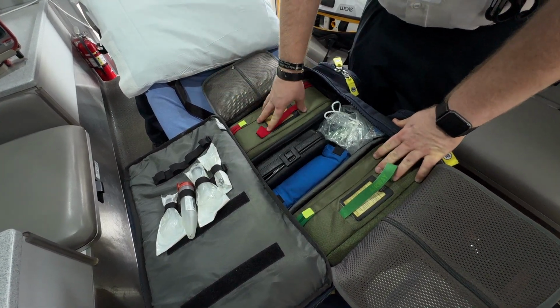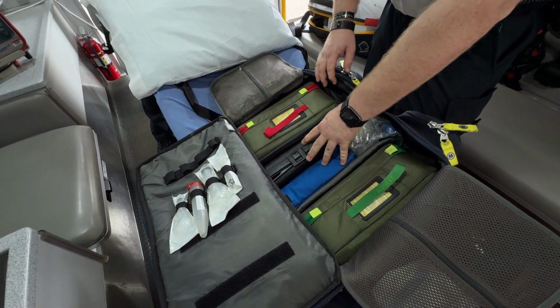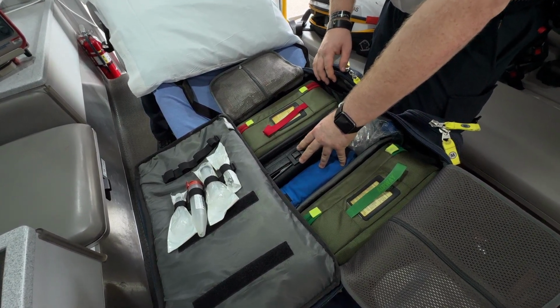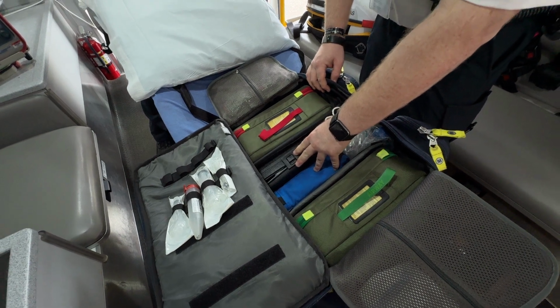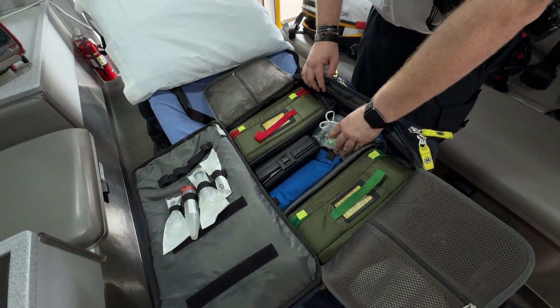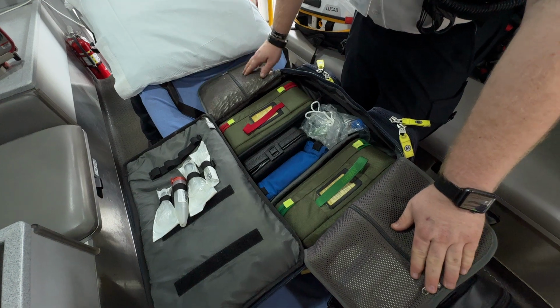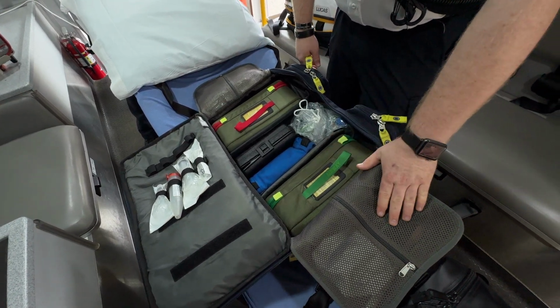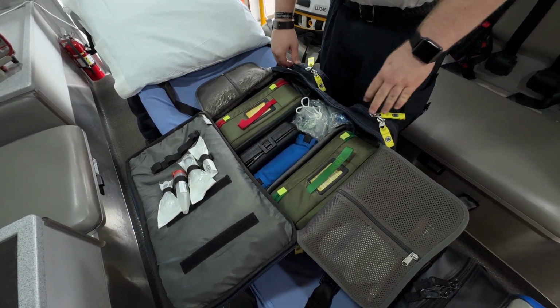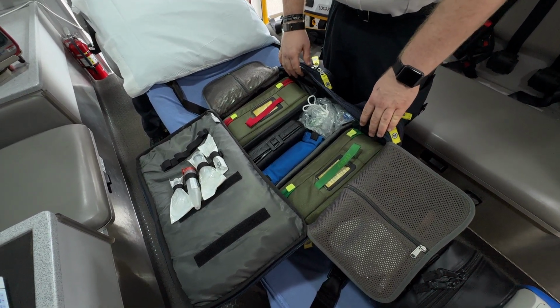We have our medications in this bag. We have equipment to establish IVs or intraosseous, which is basically a needle into your bone in case we need to give medications or fluids urgently. We carry with us a bag valve mask so we can breathe for somebody manually. And then in some of the other pouches, we have some more advanced equipment for patients who have collapsed lungs or who have open or sucking chest wounds. We can help repair those temporarily.